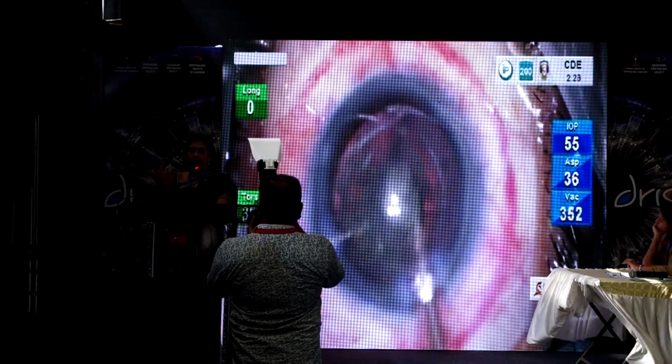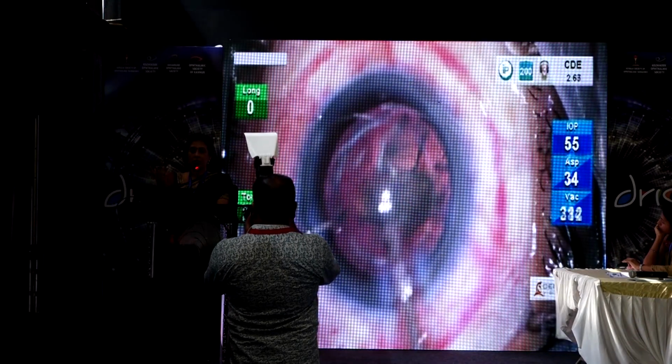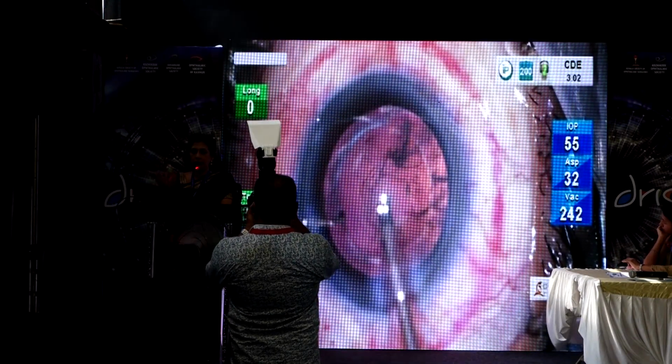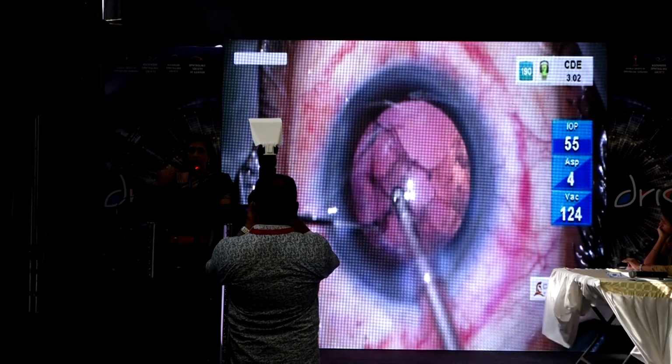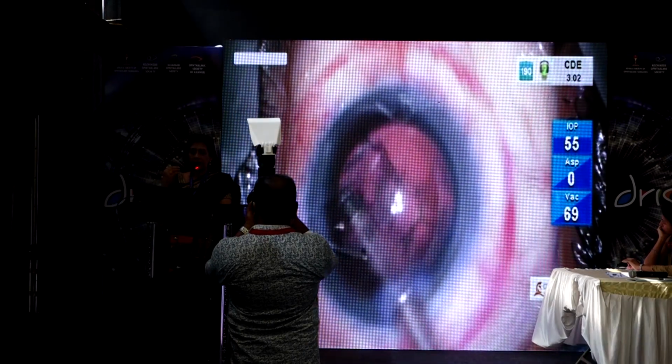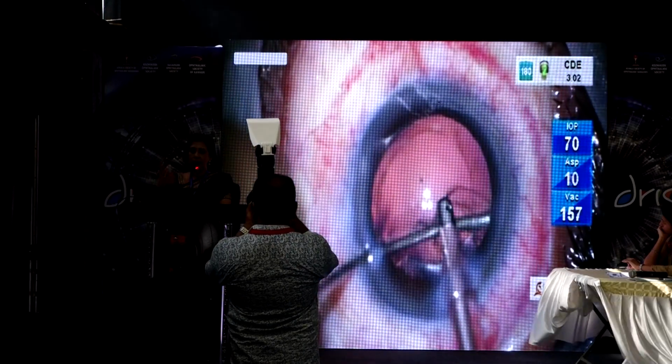You find that a polar cataract is not at all a challenging case if you are able to do it on a femtocataract platform, unless an ASOCT has told you there's a PC dehiscence, which of course then brings in its own quota of challenges in a case.